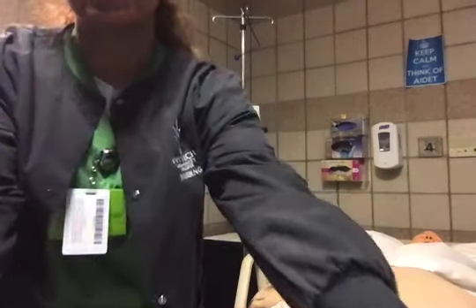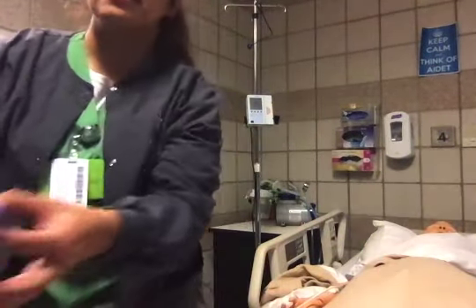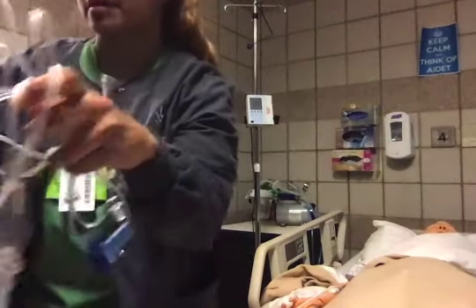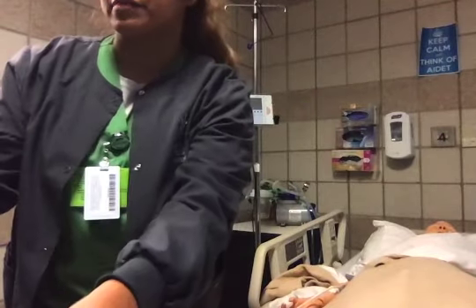So today we are going to be administering medication using the piggyback method. I will scan my area, and then I will gather my supplies. For my supplies, I have my primary bag, my medication, my primary tubing, my secondary tubing, my alcohol wipes, and my gloves.